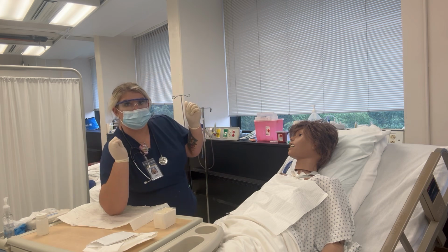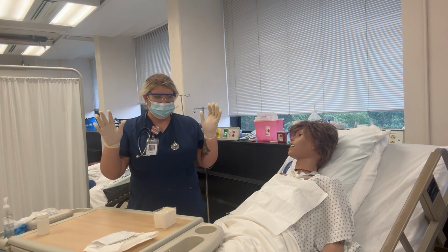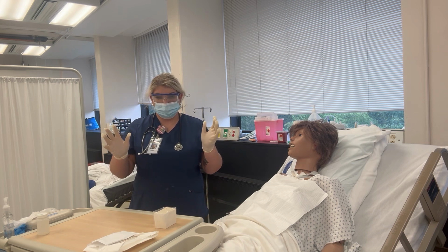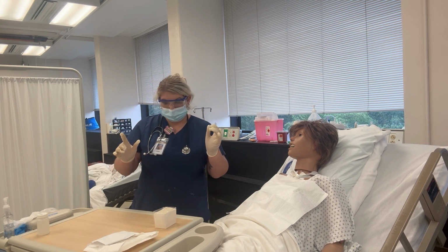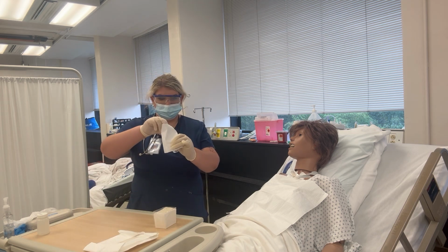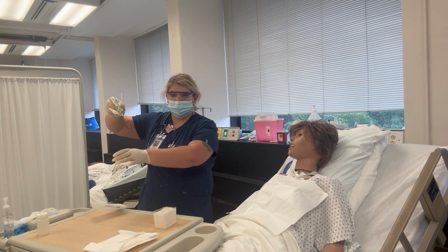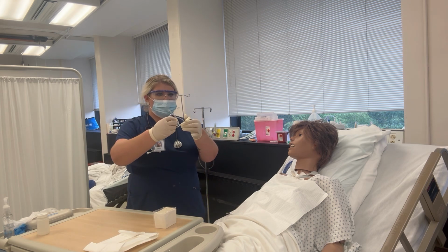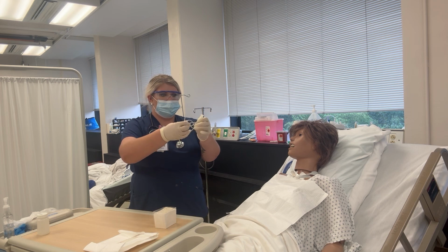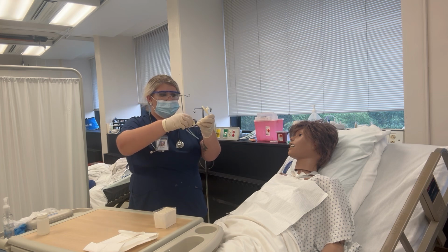Then we're going to move this out of the way. And then we're going to go ahead and begin suctioning. We're going to go ahead and take out the catheter, making sure to keep our hands above so we're not breaking sterile field.